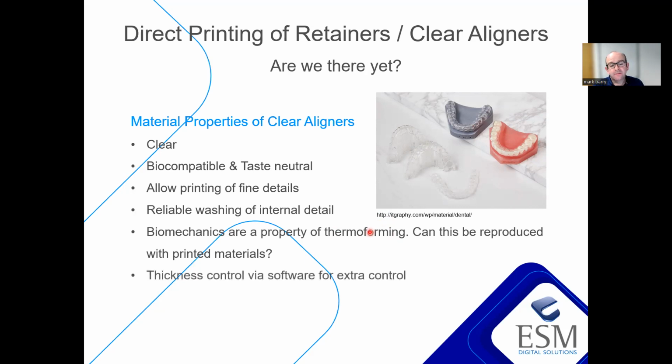Yeah, it's a bit of work to be done, a bit more evidence to start coming through. So there's thickness control. We can do that through software. There's materials out there now by Luxcrea, Centertech, and Graphy. I suppose Graphy is probably the one that's out there on the larger scale. What I think the conclusion about it is, from what we see, is that the cleaning process, the process from printing all the way through to having something in your hand that you can be confident is safe to go into the patient's mouth, I'm not going to say laborious, but it's very process sensitive. So we want to be very careful of that.